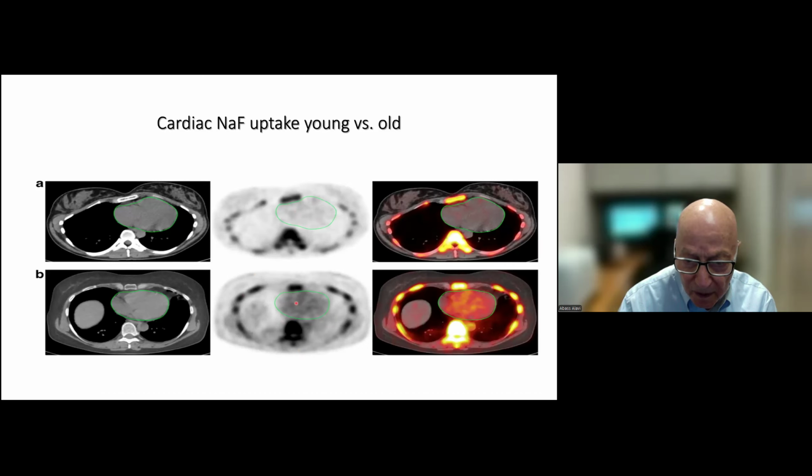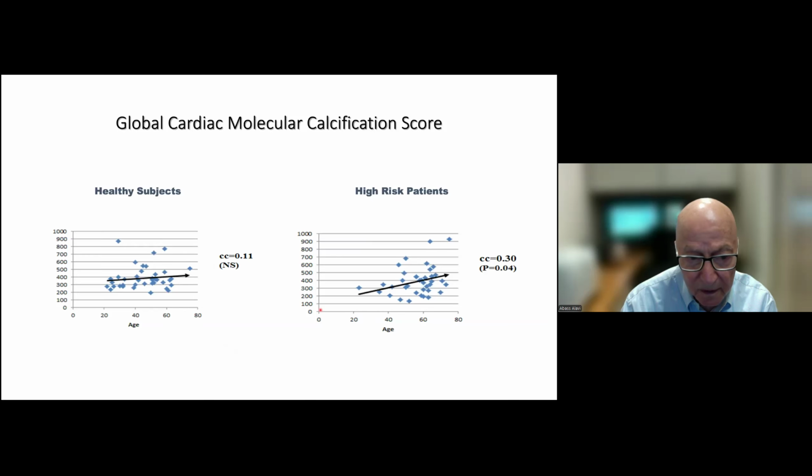showing you significant calcification. We just don't believe that we have to look at specific coronary arteries to diagnose atherosclerosis. This is a very significant, diffuse disease, and therefore, in spite of the lower resolution we have with PET, we can assess the presence of atherosclerosis in the coronary arteries, and this is going to be of great value for treating patients with coronary artery disease.